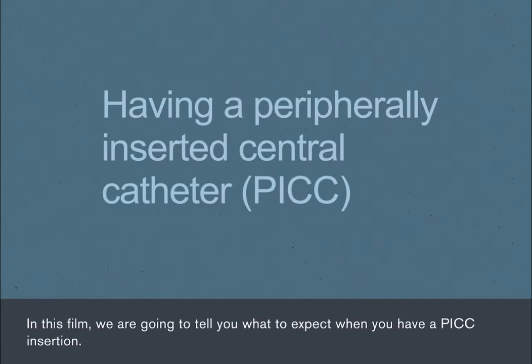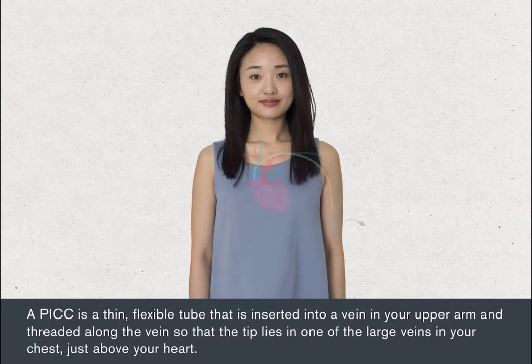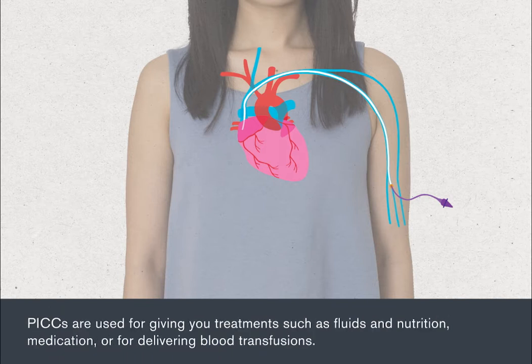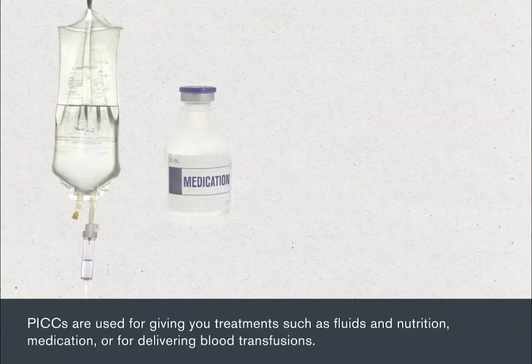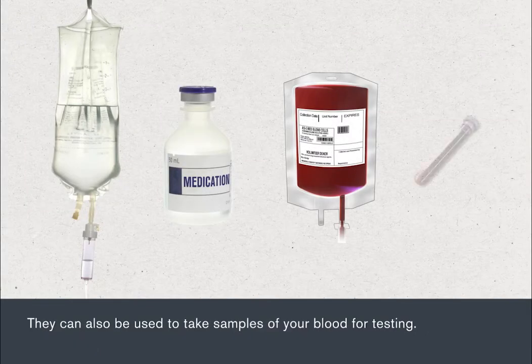In this film, we're going to tell you what to expect when you have a PICC insertion. A PICC is a thin, flexible tube that is inserted into a vein in your upper arm, threaded along the vein so that the tip lies in one of the large veins in your chest, just above your heart. PICCs are used for giving you treatments, such as fluids and nutrition, medication, or for delivering blood transfusions. They can also be used to take samples of your blood for testing.